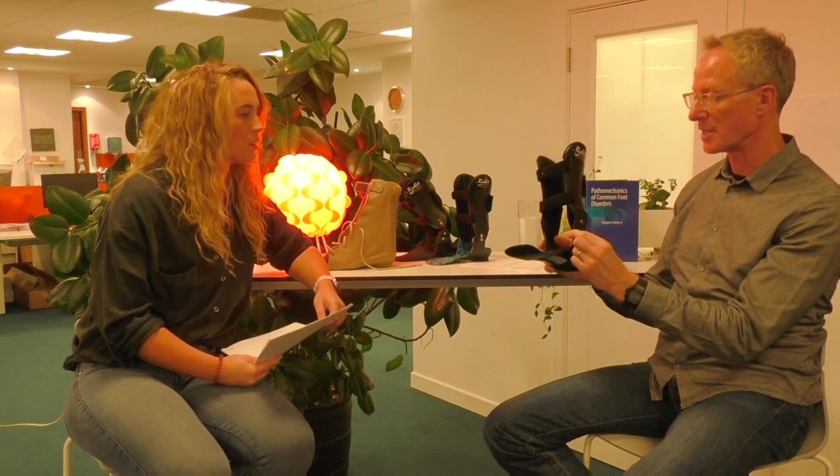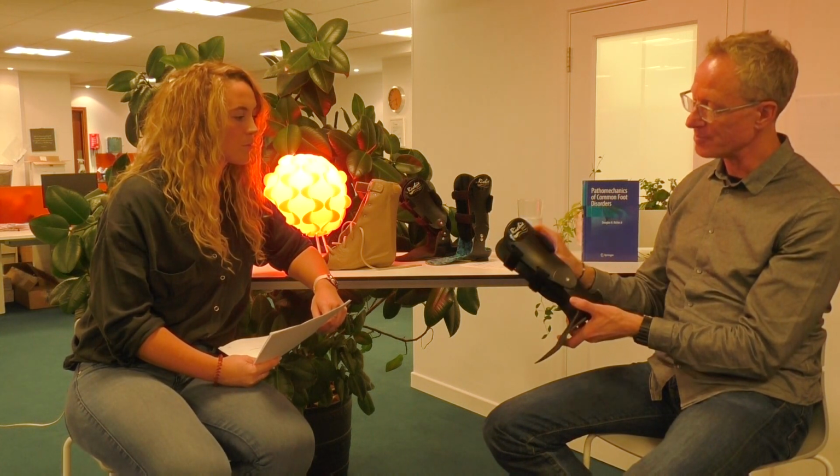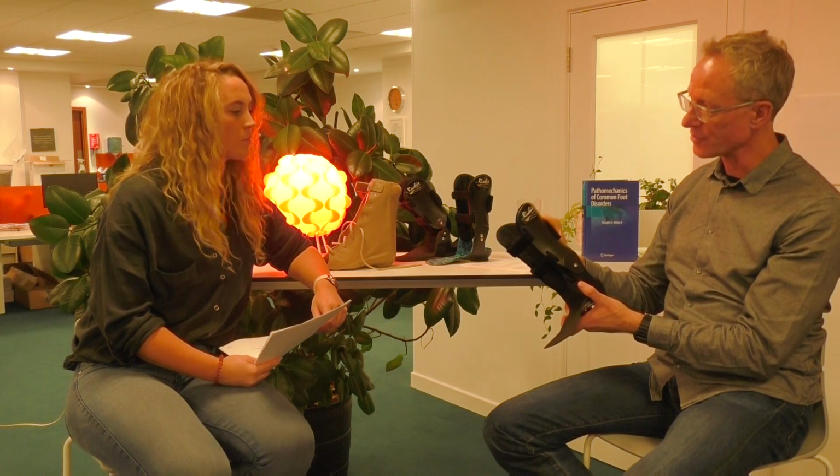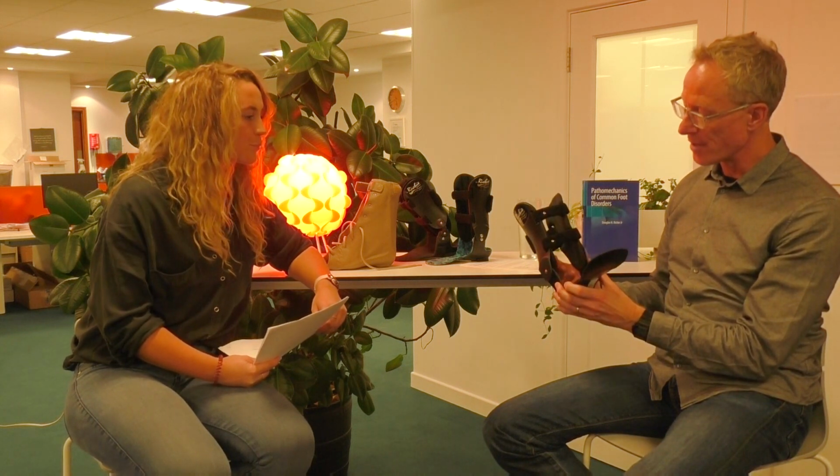And then you have these uprights that are made specifically to the axis of the joint. It usually comes with a sulcus length extension. You can have that to the mets, or you can have it full length. The uprights, as I say, are mass produced, and then you have a thicker strap at the back for anchoring it, and two at the front, and these are riveted in place. Inside you've got soft padding, and bear in mind that all of these components can be changed.